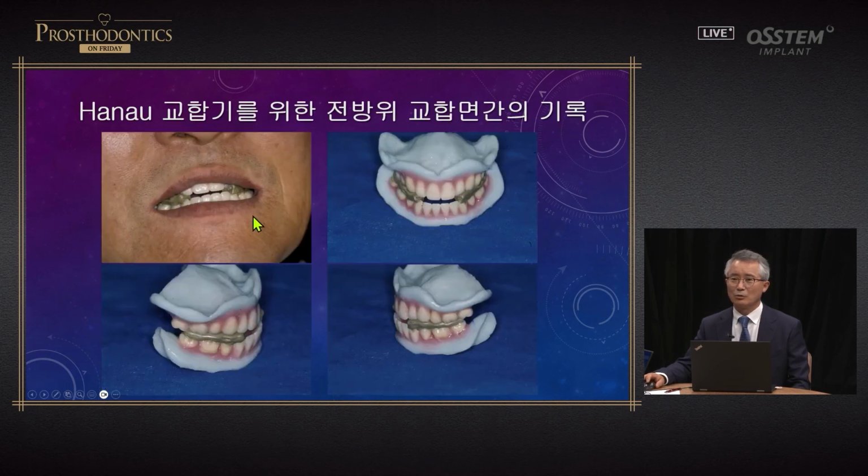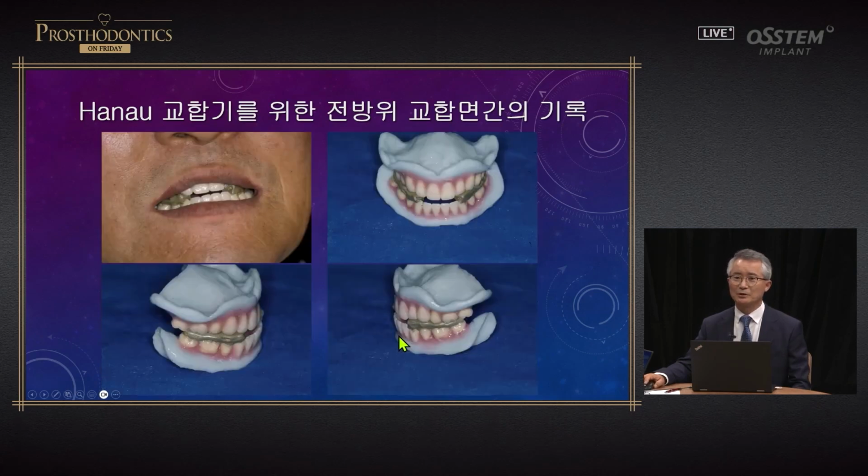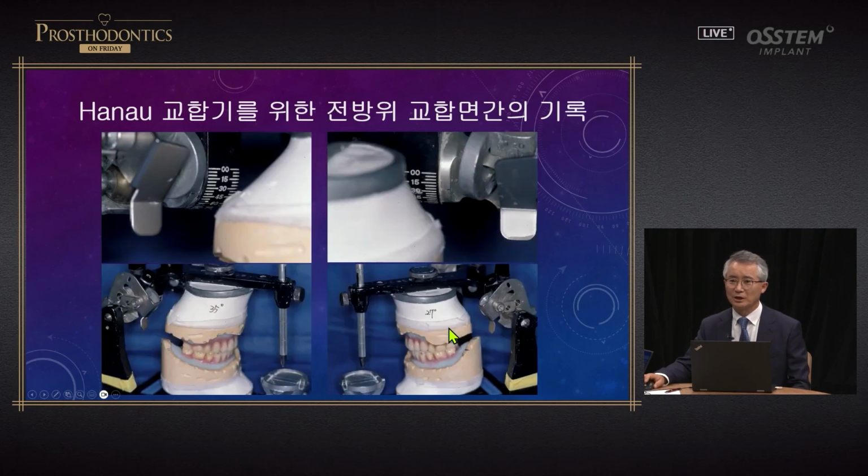The markings are made on the top and the bottom, and there's another layer in between. You look at the indentation and you put it intraorally and do softening. And then you guide the teeth. 6 millimeter protrusion occurs. This is slightly tilted. And then you put this on the articulator and condylar guidance is done. You can see that the indentations are made surely, and this is 35 degrees and this is 27 degrees. You need to mark it here.